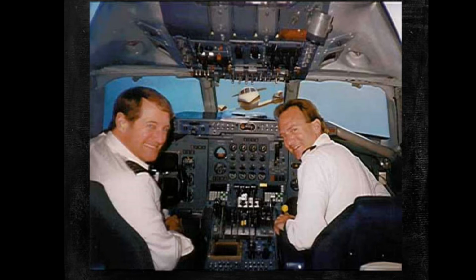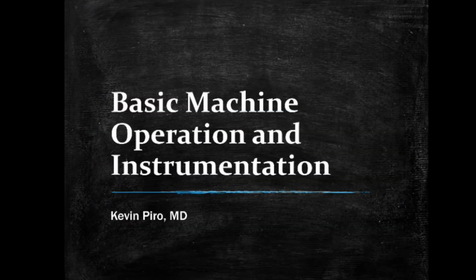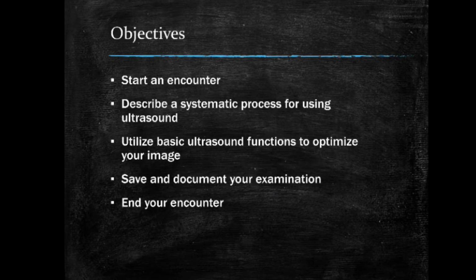The more we understand the buttons and knobs, the better we're going to be able to optimize our image and make a better clinical decision. So today I'm going to give you the foundations for operating an ultrasound machine. Now, these are going to differ from machine to machine, but the basic structure is going to be about the same. And so it's just being familiar with the machine and operations and what the ultrasound can change.